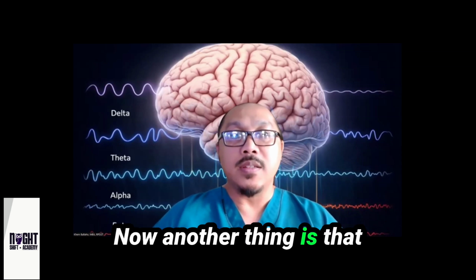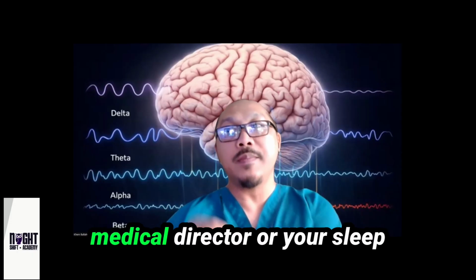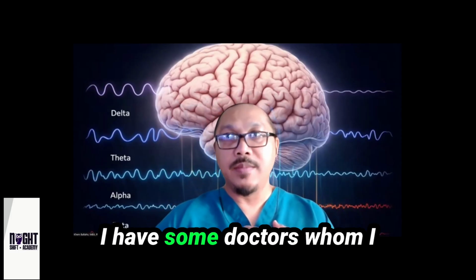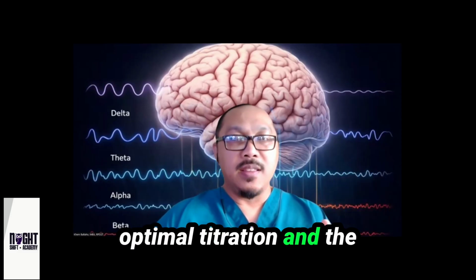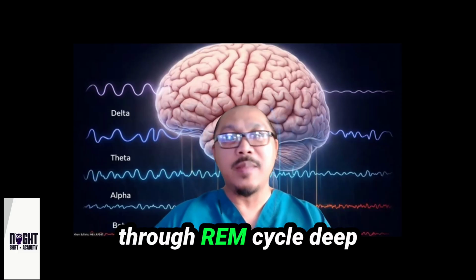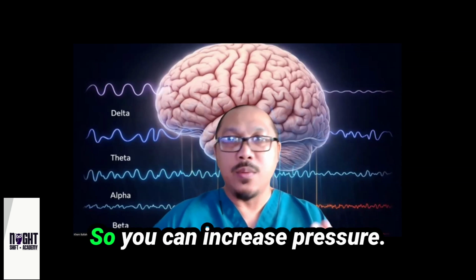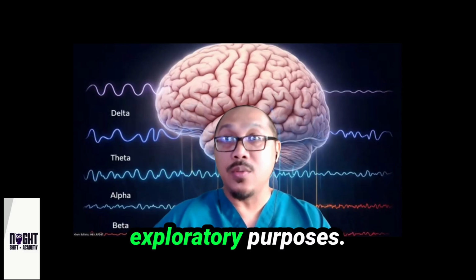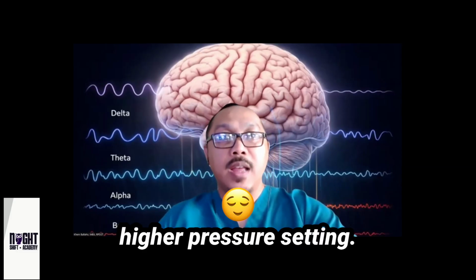Now, another reason why you can adjust pressure is if your medical director or your sleep physician encourages you. For example, I have worked for some doctors where I had the patient on optimal titration and the pressure was at 5 all night. 3 hours later, the patient is going through REM cycle, deep sleep, and N2, etc., but nothing's happening. So you can increase pressure and state that you are increasing pressure for exploratory purposes. I need to say you're trying to find the threshold if the patient can tolerate a higher pressure setting.